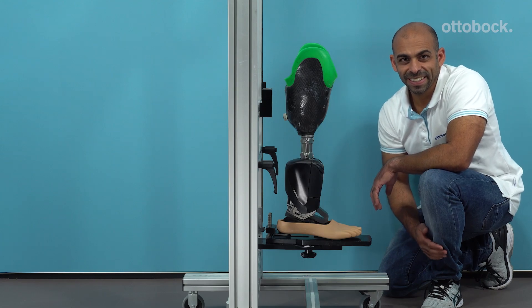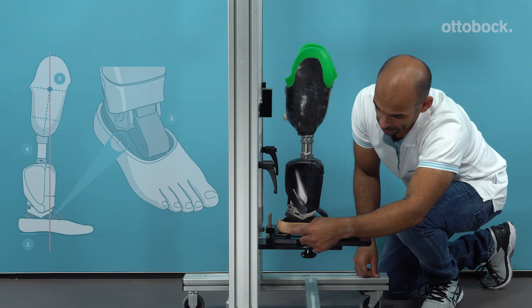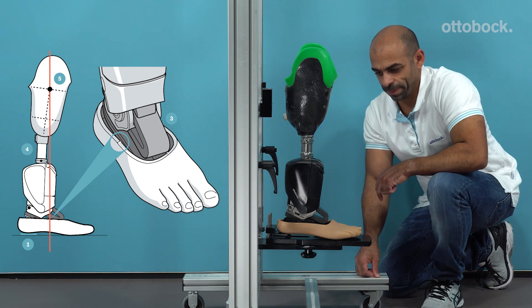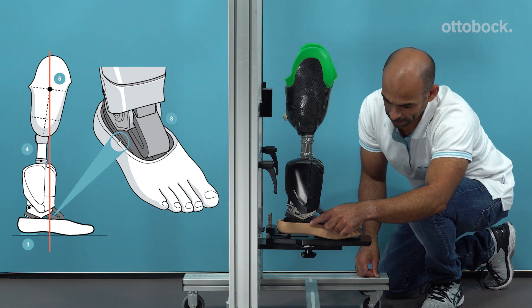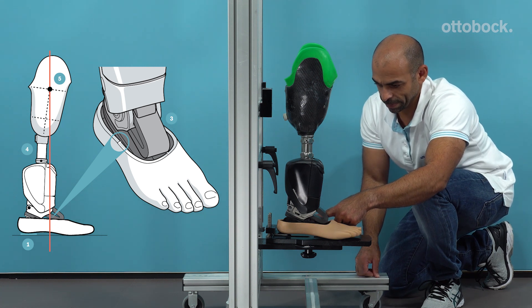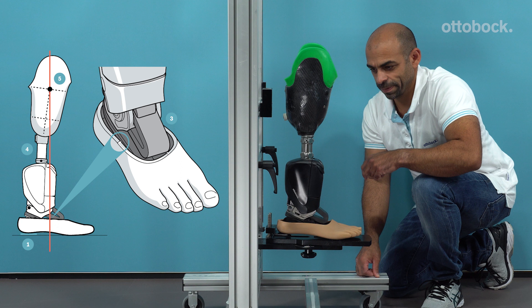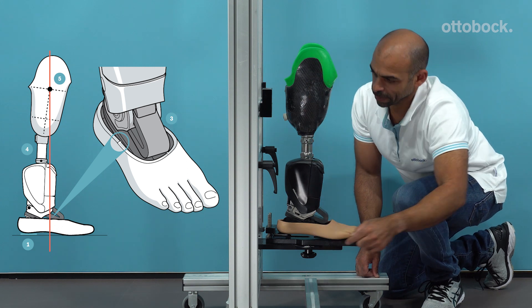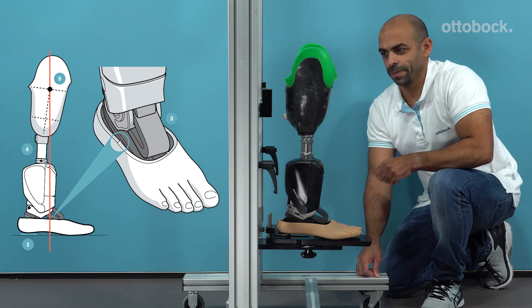Please follow the app instructions for the bench alignment. The effective heel height of the shoe is five millimeters. In the sagittal plane, the alignment reference line should run through the medial and lateral markings of the foot shell. Connect the prosthetic foot with the prosthetic socket using the adapters. For socket flexion, the alignment reference line should run centrally through the prosthetic socket, then adjust the socket flexion as needed.